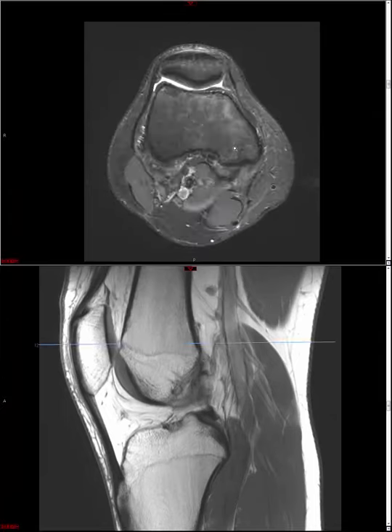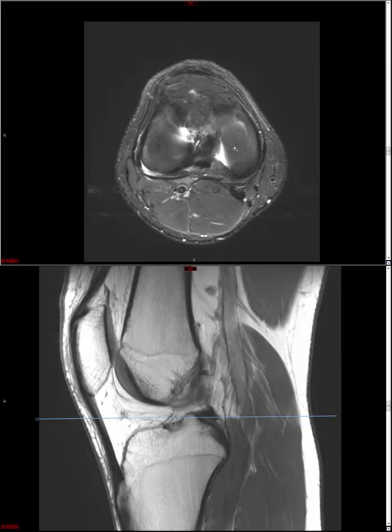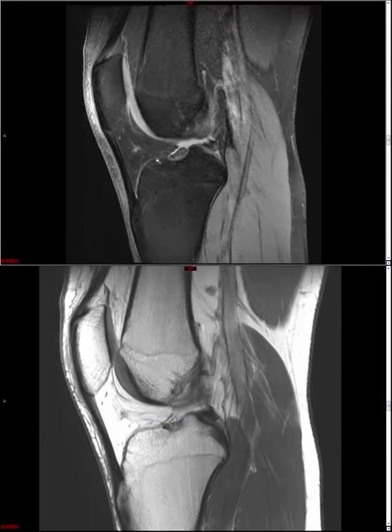And then we scroll more inferiorly and we look at the patellar tendon. Some people call this a ligament because it attaches one bone to another. I like to liken it to a tendon because I feel like its function is more that of a tendon, but I think that's a minor point. The patellar tendon should generally have homogeneous low signal like other tendons.